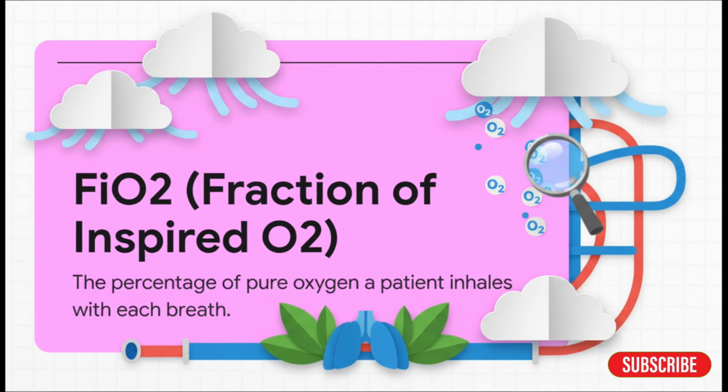Okay, before we even think about touching a single device, we've got to learn the lingo. And the most important term you need to know, bar none, is FiO2. Now, don't worry about some complicated textbook definition. All it means is the percentage of pure oxygen that your patient is breathing in with every single breath. Get this, and everything else we talk about is going to make so much more sense.